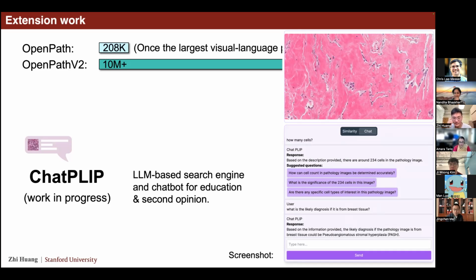Another little bit more information: if your input image's magnification is too low, if we cannot tell the cells, like if it's just an overview of the whole slide image, then we just don't count the cells.